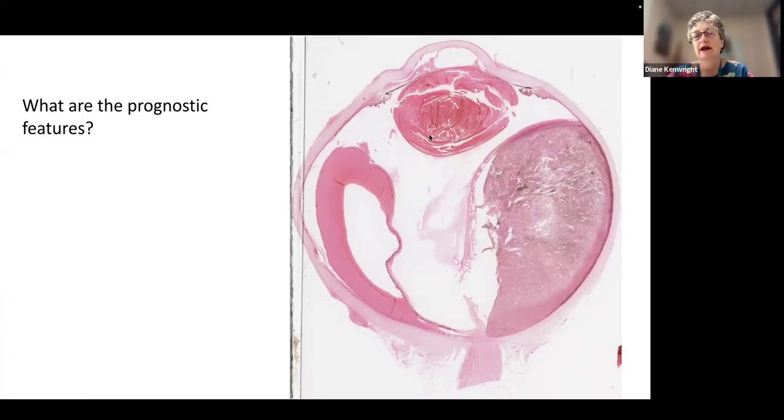We've got another eye with a slightly displaced lens. What else is going on here? All right. So the iris looks a bit flat, so we suspect neovascularization. Certainly it looks pushed down here, but there may or may not be neovascularization at low power. We can see that the tumor is still ovoid, though it has a really, really big basal diameter and a really large height. So this will affect the stage. So the most important prognostic factor here is probably the tumor size. It has not invaded the optic nerve.